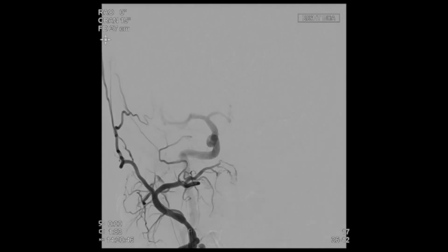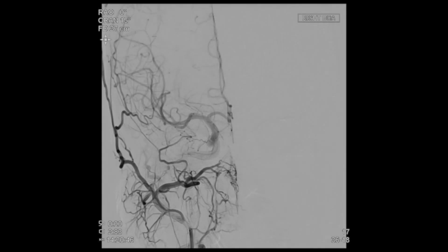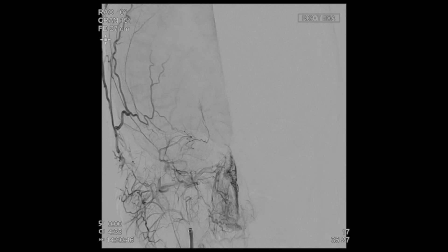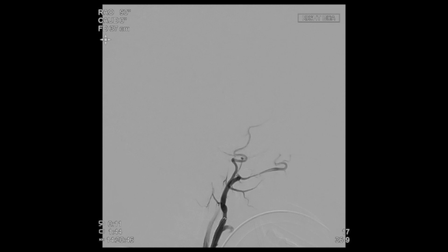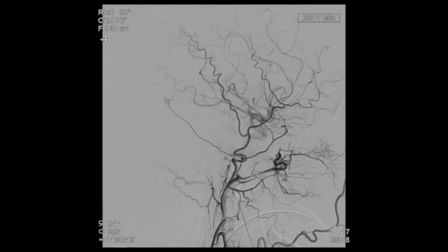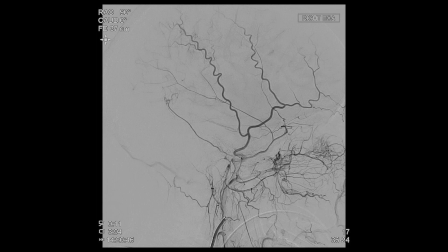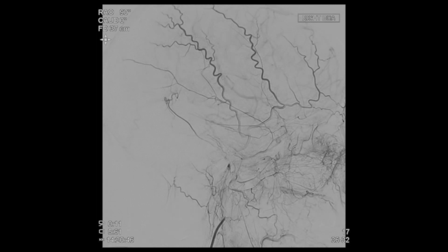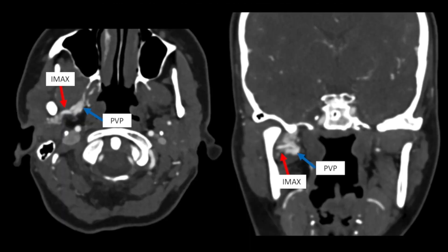Post-treatment angiogram demonstrated complete resolution and angiographic cure of the arteriovenous fistula. We performed a complete six-vessel angiogram following the procedure to confirm there were no additional feeders to the arteriovenous fistula. A concern was raised regarding the potential of coils protruding into the buccal mucosa surface; however, as seen here, the malformation was separated from the buccal mucosal surface by a layer of pharyngeal constrictor muscles.